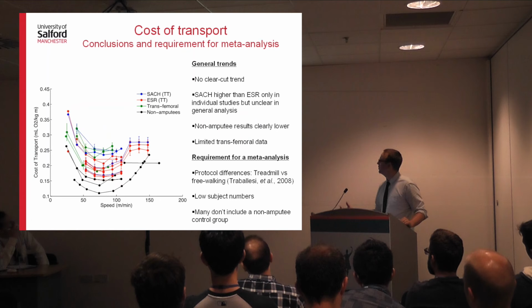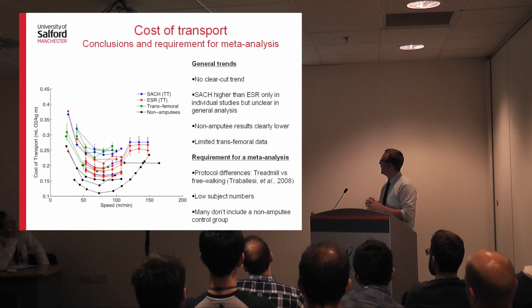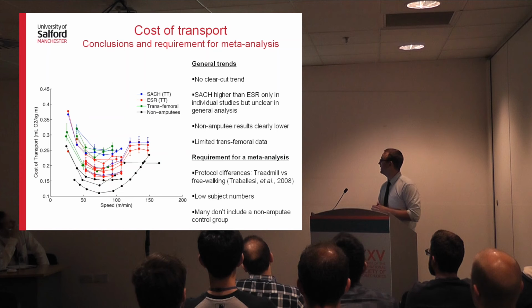One thing we spotted from the data is SACH feet seem to be higher than your ESR feet, but that's not often statistically significant. It's just a trend. Non-amputee results are clearly lower, but they also have quite a bit of noise in them. Across the literature there is actually quite limited transfemoral data, so we can only really talk about transtibial data for this. Like I was saying before, protocol differences make a big difference.